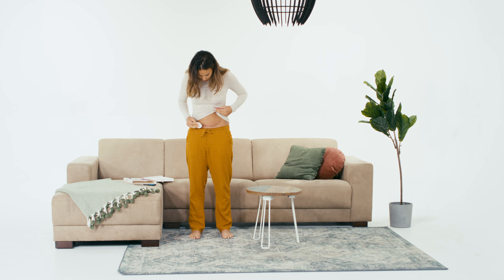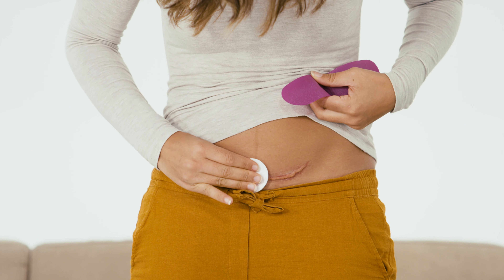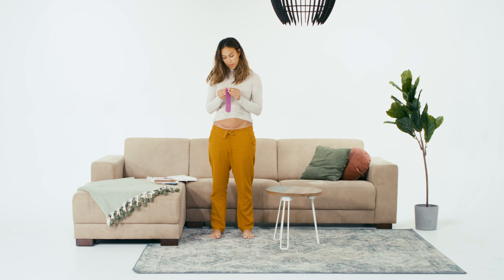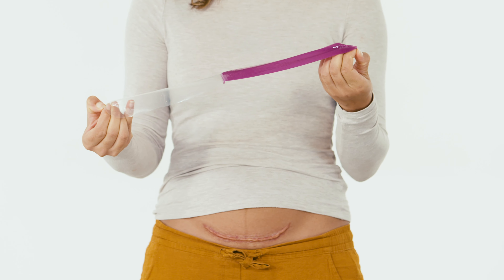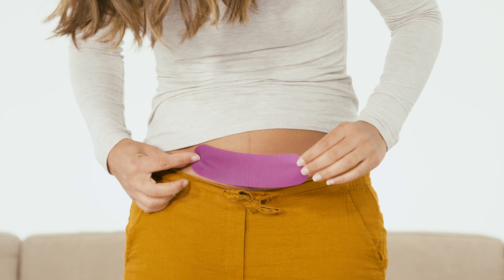If necessary, the Scar Band silicone sheet can be cut to the correct size. Remove the protective film from the back of the silicone sheet and apply Scar Band to the scar. Make sure that the silicone sheet extends two centimeters beyond the edge of the scar.